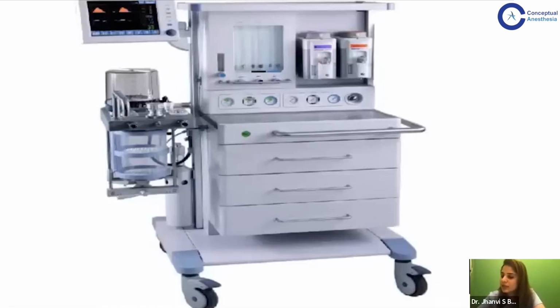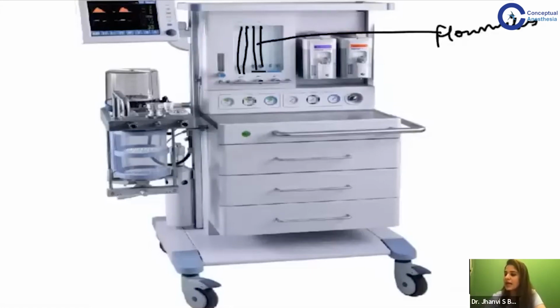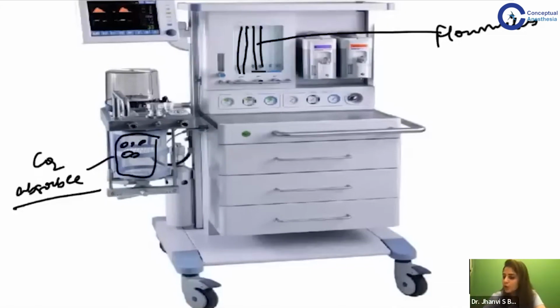The next thing you need to identify in the machine is these glass tubes over here. These glass tubes are nothing but flow meters. And one more thing you need to identify here, you will have a dabba of carbon dioxide absorber. They will ask you in the exam, what is the most common carbon dioxide absorber used? And this you should know. The most common carbon dioxide absorber that we use is called soda lime.